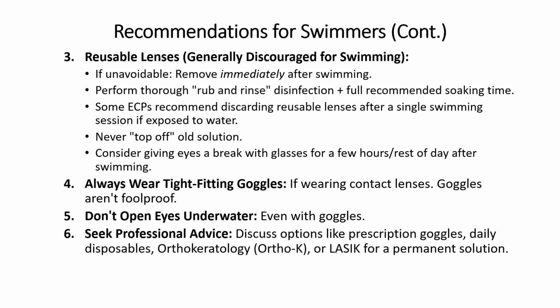Most importantly, seek professional advice. Discuss your swimming habits and needs with your eye care professional. They can provide guidance on the safest options for you, which may include prescription swim goggles, daily disposables, alternatives like orthokeratology, which reshapes the cornea overnight, or even discussing refractive surgery like LASIK for a permanent solution if you're a very frequent swimmer.